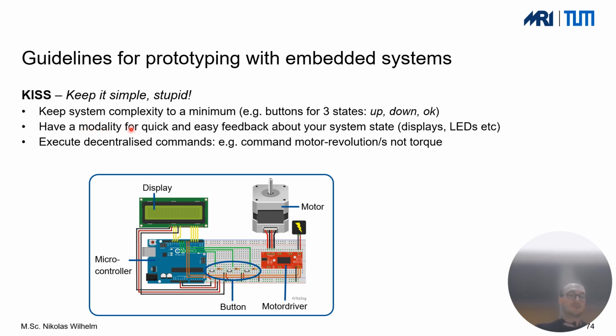Something that is really nice is if you can somehow easily, I would call it, debug what is actually happening in your system. So maybe you have a status LED or some kind of clever way of informing yourself about the respective system states. If you, for example, use something like an external mobile application, once everything is figured out with the mobile application, you can then, of course, easily extend this debug process by displaying lots of values of interest. But in general, it's a good idea to also keep that on the low level. Some LEDs that would just tell you that everything is set up correctly is already very, very helpful.